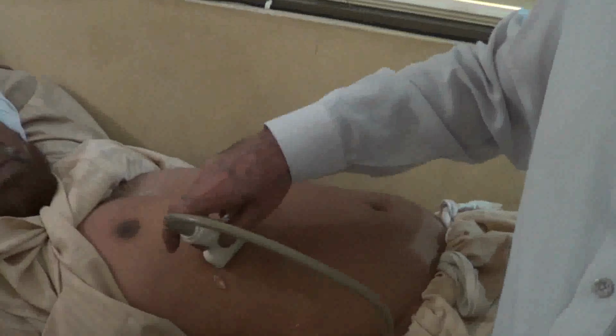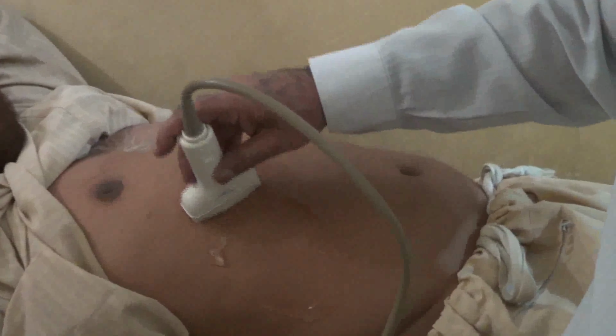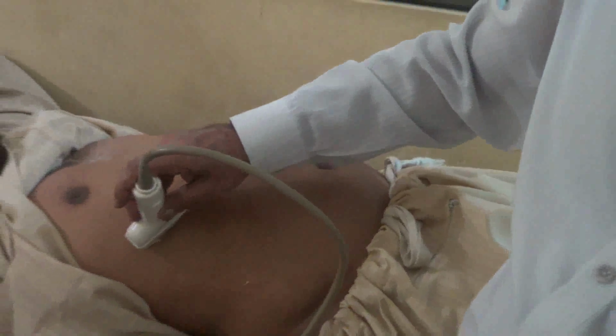We are going to scan this gentleman, age 48 years, who has been referred as a cirrhotic patient to rule out any focal lesion in the liver. We will be performing the ultrasound of this patient, and you will see that you will get different findings. Now I will perform the ultrasound on this same patient, but in segments, because he is having three different pathologies. So let's start the scan.